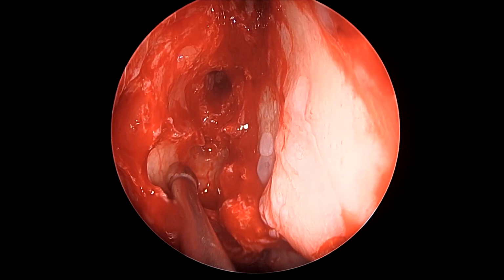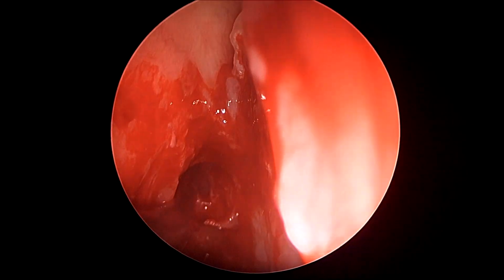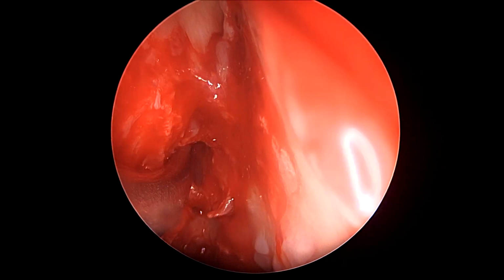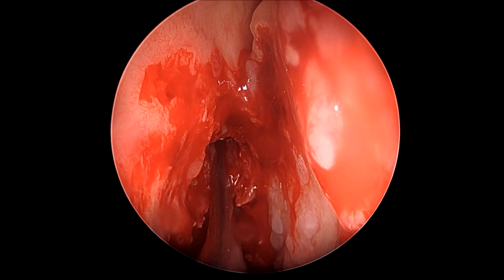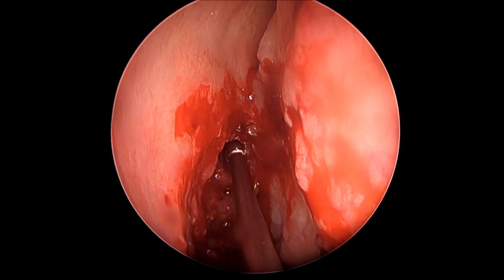And here we resort to an angled telescope to reorient ourselves in the skull base. You can see here how the frontal recess and the frontal sinus are very clearly visible, and a suction can very freely move inside the frontal sinus and recess, and you can see the orbital movements, the ballottability from outside.